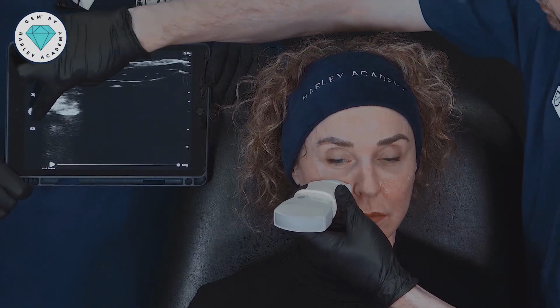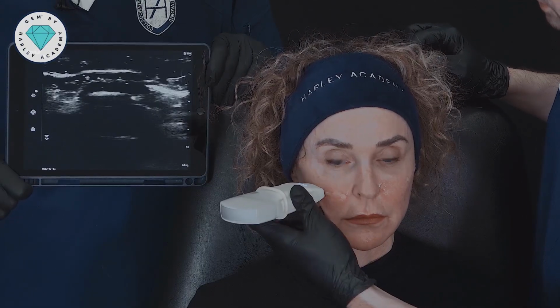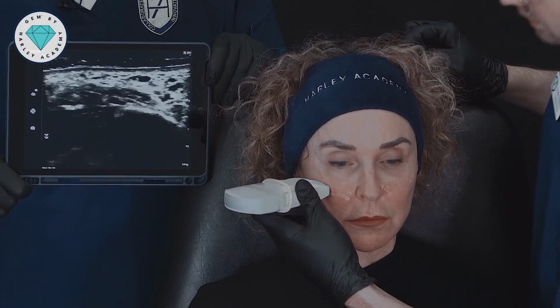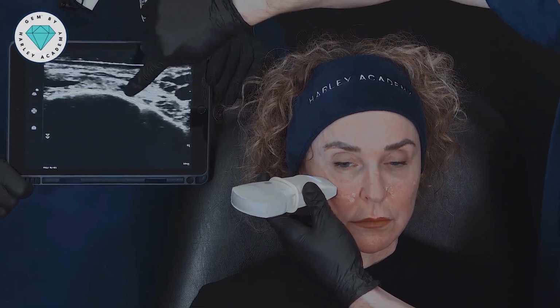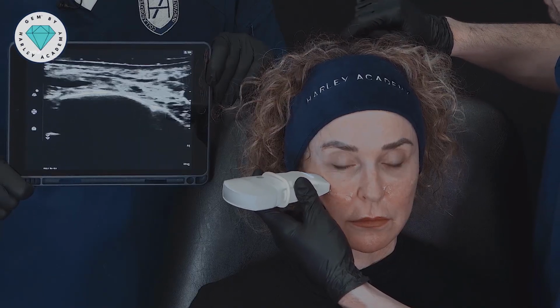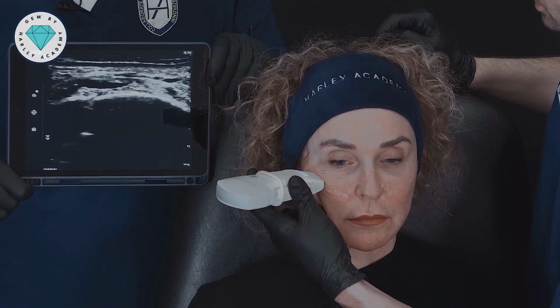Let me just unfreeze that. Oh, and again, straight away. So let me start at the zygoma so we can find where we are. So again, you can see this white structure under here. That's our zygoma. And you can see, actually, some filler over the lateral zygoma.